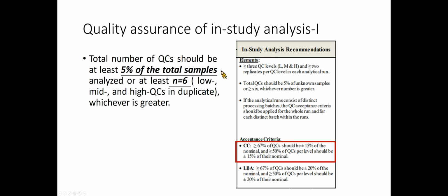The QCs should be interspersed with study samples during processing and analysis. In each analytical run, the lack of analyte interference at the LLOQ should be confirmed. The analytical run fails if the calibration or QC acceptance criteria are not met.